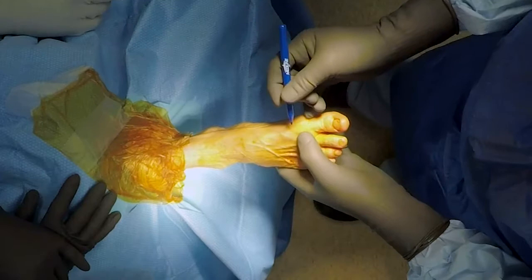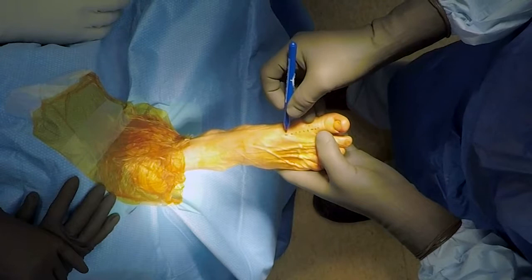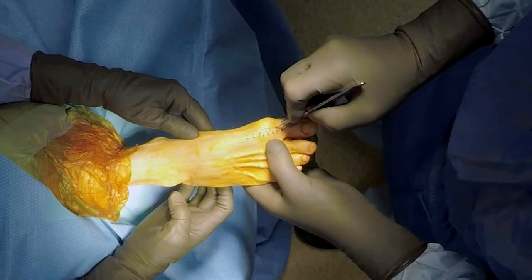I can see the extensor hallucis longus tendon. Some people will cheat a little bit more here for cosmesis, but I find that makes it hard to get to the lateral side. So I'll just cheat to the medial border of the extensor hallucis longus. Once we've done that, basically make an incision just going off that medial border of the extensor hallucis longus.